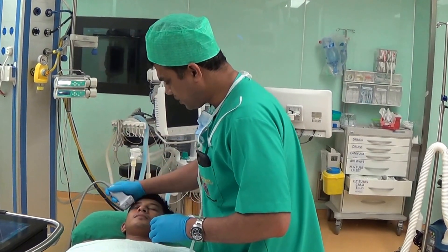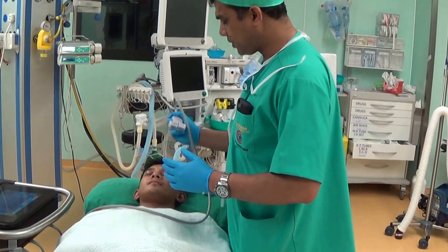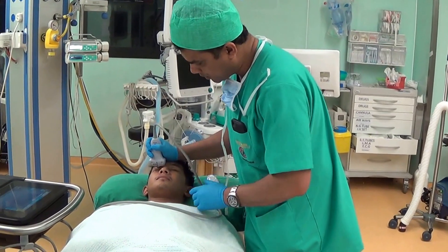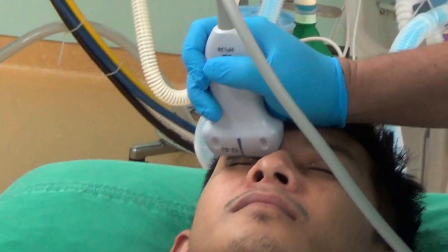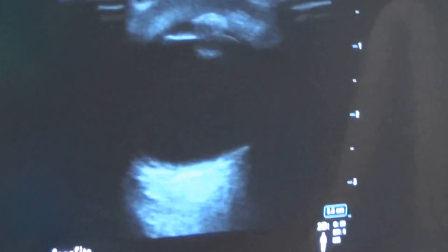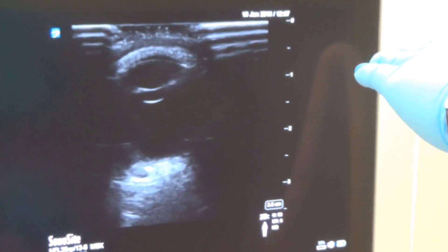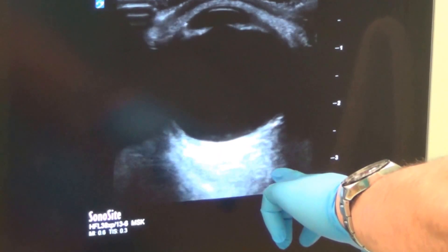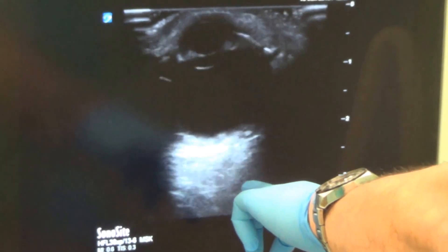As an anesthesiologist, we are interested in knowing the optic nerve sheath diameter. You put the probe as gently as possible over the eyes and look for the globe. The structures you are seeing are the anterior chamber and lens — both very clearly visible. The posterior part of the lens is also visible, and coming down, this is the area where you see the optic nerve.